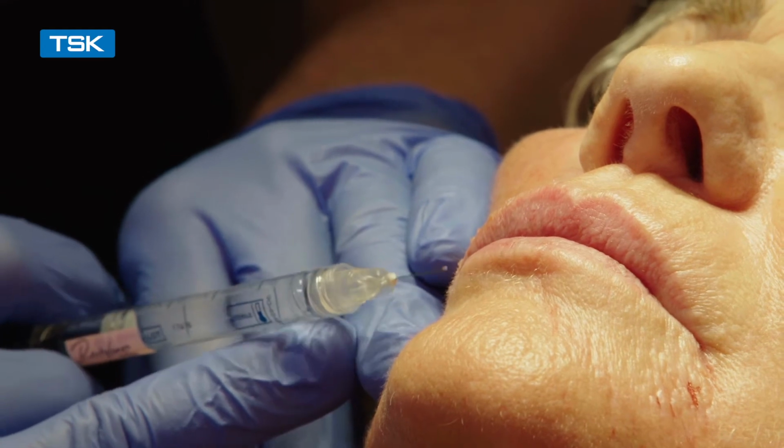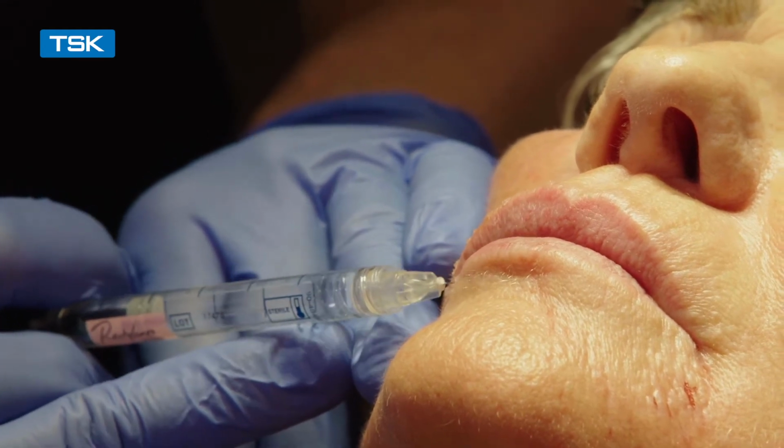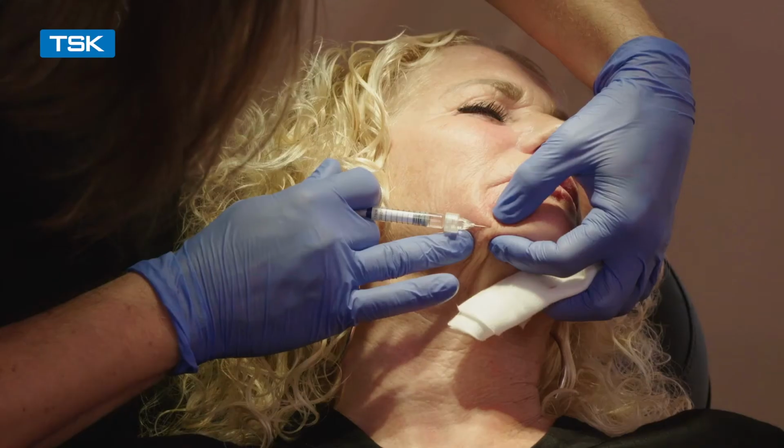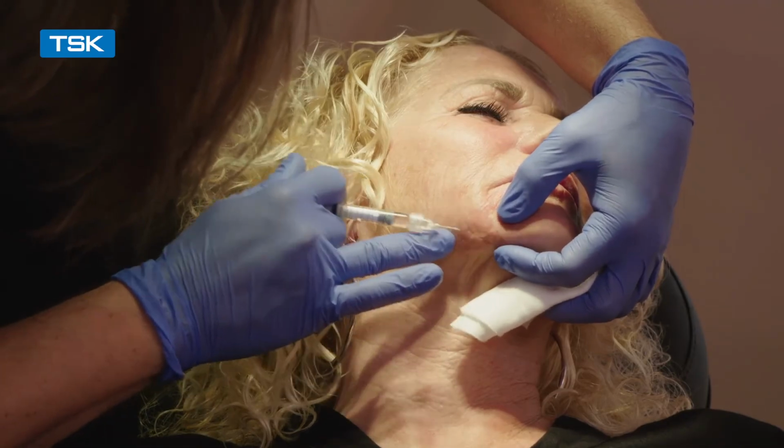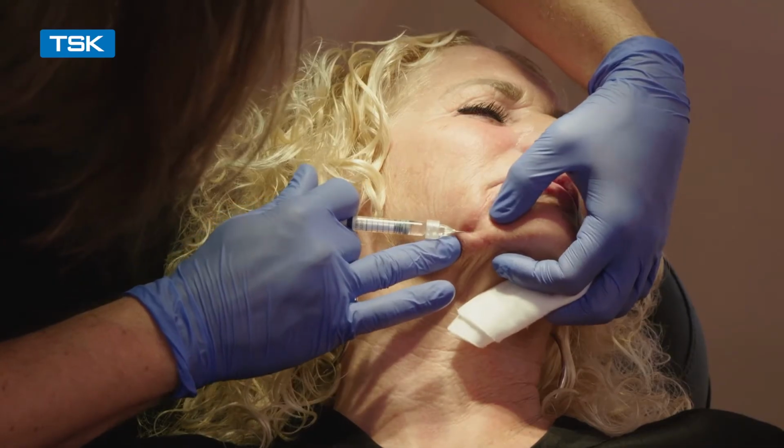On average, I think I use about 24 injections each side for a lip to divide the gel into small portions. If we talk about 1 mil on average for upper and lower lip, I think 2 times 24 is my average of injection points. With the Fern pattern addressing the skin, that might be 50, 60, I don't know, it's a lot. Basically every pore that is not as strong as I want it to be gets hit to make sure you have a nice spread of material.